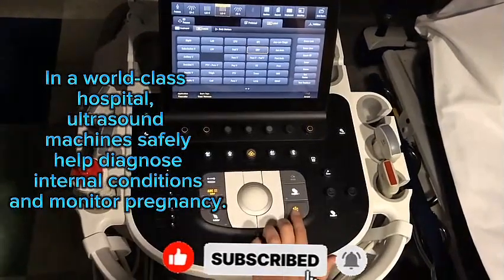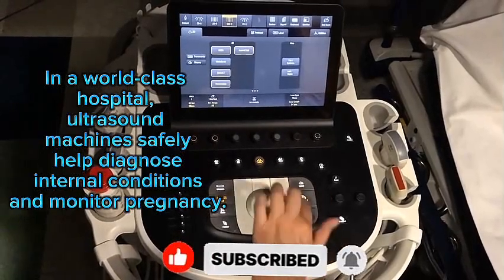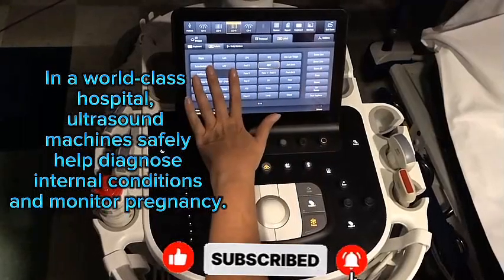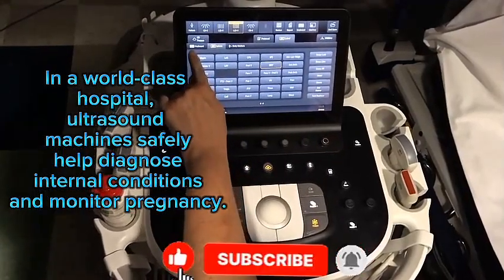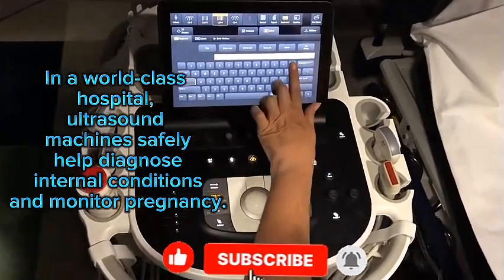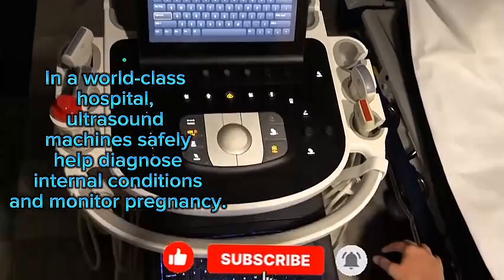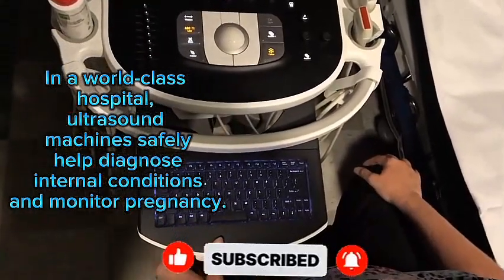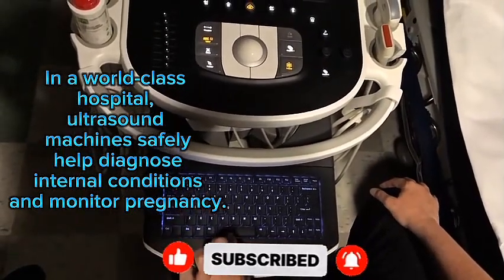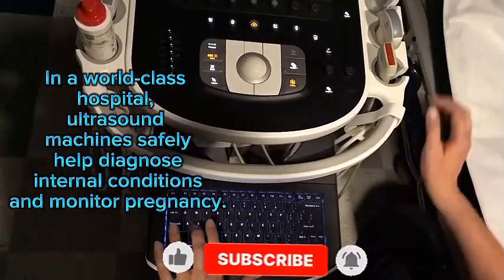Once you have the image that you would like to store, you hit freeze, and you can either use the automated annotation or choose this selection, the keyboard, and then a keyboard will appear on your touch screen. Or if you prefer, you can pull this keyboard out from the bottom of the machine, and at any point to initiate this keyboard, you hit the space key and the annotation will be ready on here.